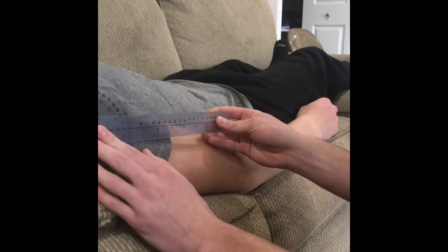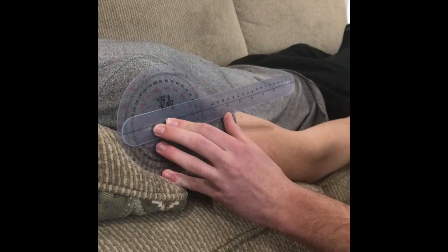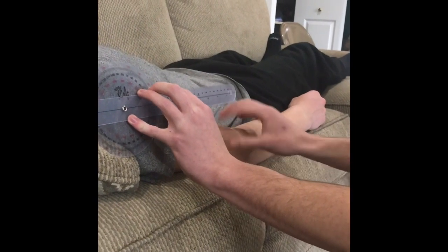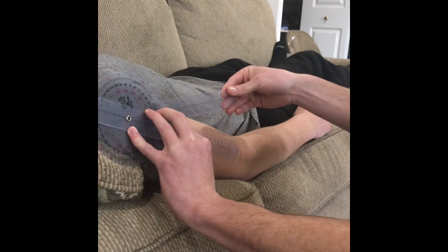All right, so now we're going to be using the goniometer to measure the shoulder flexion of a patient. In order to do this, you need to take the goniometer, position it at the shoulder joint, and have the stationary arm parallel with the table or whatever surface that you are on. And then the movement arm is going to be lining up with the humerus and keeping all along that line.